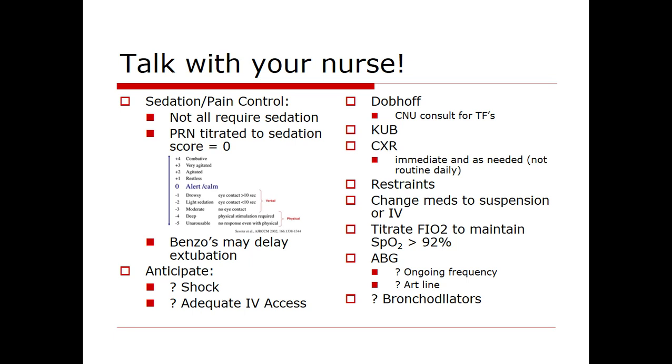Because if we make a ventilator change and we leave the room, if something goes wrong with the patient, and nobody knew that a ventilator change had just occurred, they're not going to immediately look to that as the cause of the deterioration. So please put the order in, and you got to tell one other person, either the nurse or the respiratory therapist, whenever you make any ventilator changes. It sounds draconian. You're doctors, you got to be able to do these things, but for patient safety, document it in Epic and communicate it to at least the nurse or the respiratory therapist, if not both.